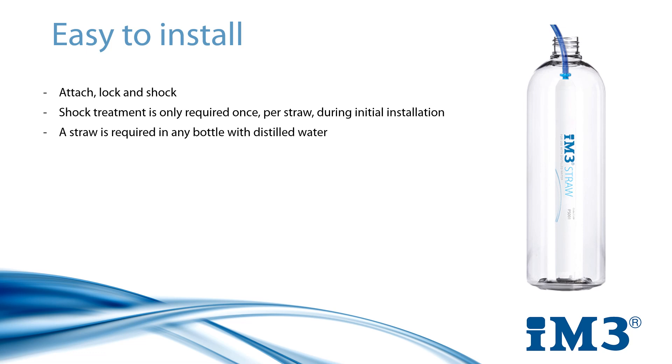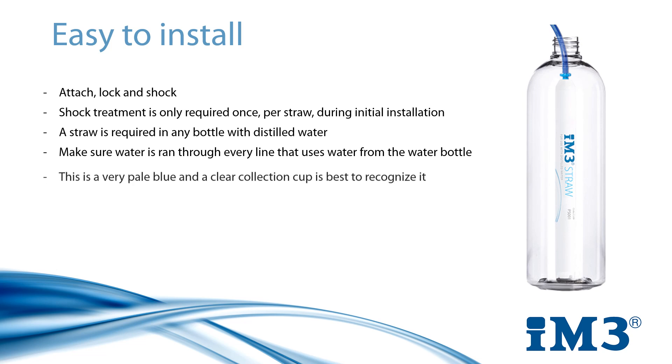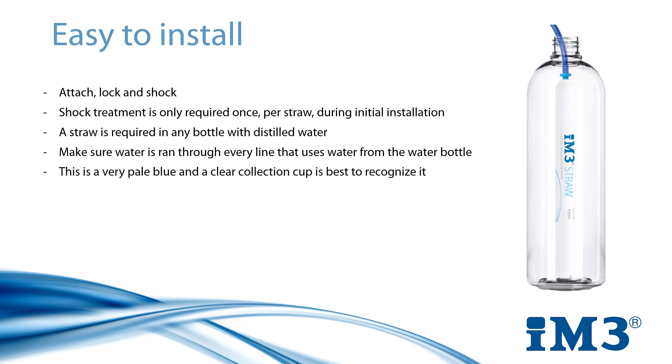Reattach your bottle, turn on your machine and pressurise. To start the shock treatment, run water through each of the lines that carry it. These lines may include your three-way syringe, your scaler, a high-speed handpiece and possibly any other low-speed handpieces that carry slow water. For each, you should begin to see a very pale blue water in your collection cup. Do this for each of them before moving on until all of them have displayed this coloured water. You should now leave your water to sit in the lines for a minimum of 12 hours, and if possible leave it for longer, possibly over the course of a weekend.